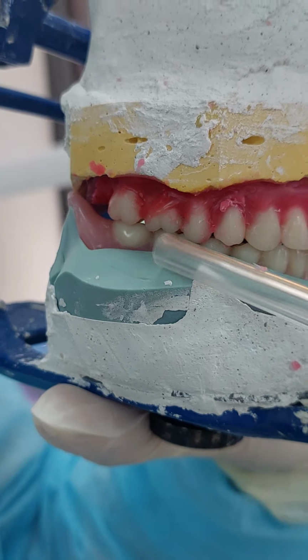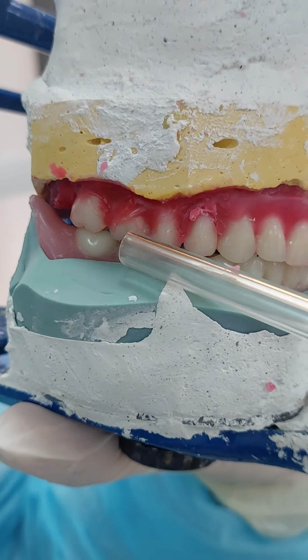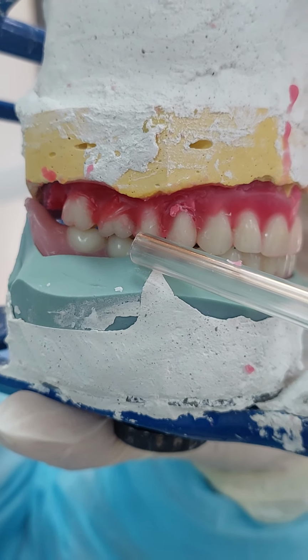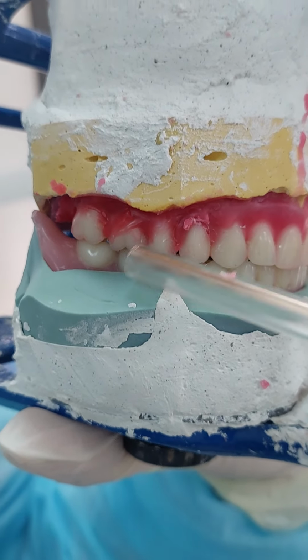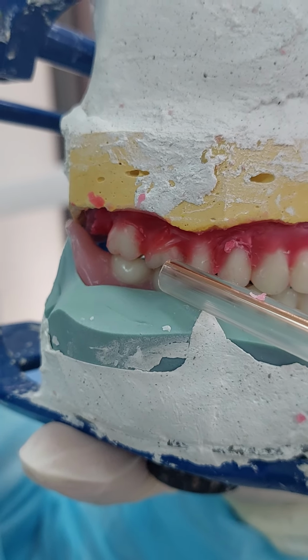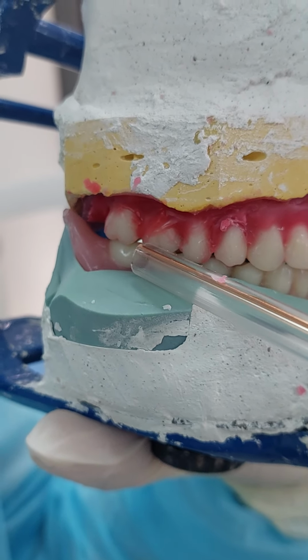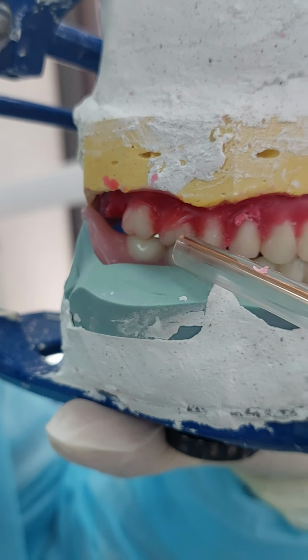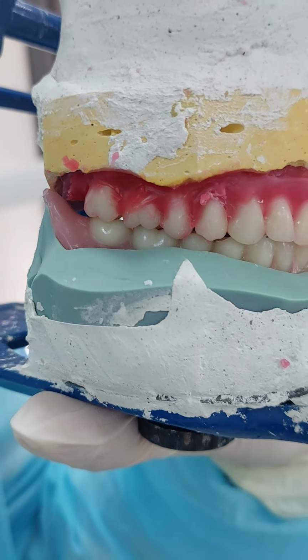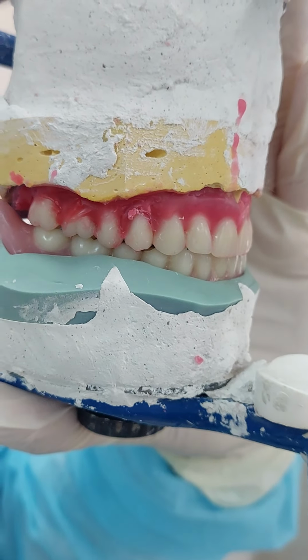How do I adjust it? In the case here, you can adjust it with moving wax. In my case, what did I do? The denture was processed, and I had a tooth with this type of occlusion that I did not notice. What do you do? You add composite and acid etch it. By the way, composite bonds to these teeth excellently. Clean the wax first, acid etch, bond, and then add a drop of flowable composite, creating a buccal bulge. In my case I added it distally and mesially. In your case, if somebody delivered something like this and you want to adjust it, add mesially. But here, because we are in the trial, do it in wax and move it. It could be solvable even in complete dentures that have been delivered and processed. So add composite to add this bulk and prevent the scissor biting on the cheeks.